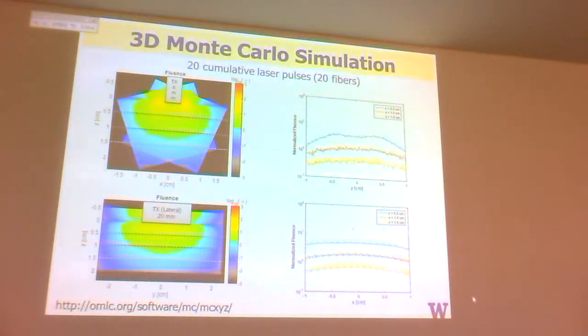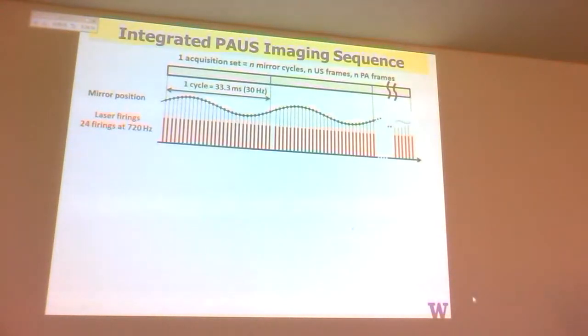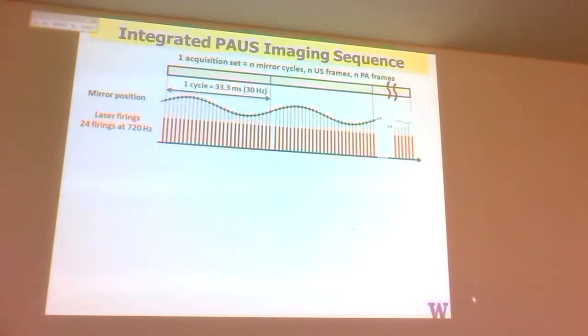So the ones you heard about last night, we just took a standard one from Steve Jacques, who's in Oregon, worked with Lihong, that code, and we use it to try to optimize the timing, the delivery, the overlap, to optimize for specific applications. You don't need that stuff. Okay. Then, this is what's different about one of these types of systems we're moving towards the clinic.